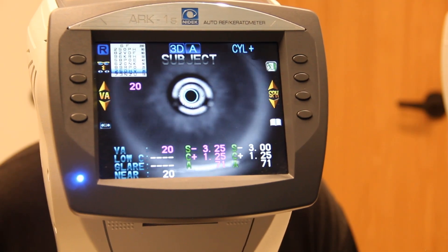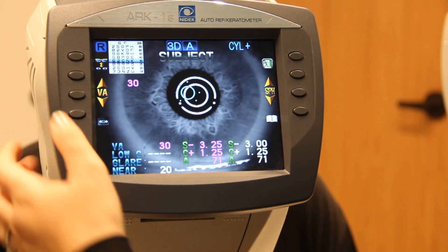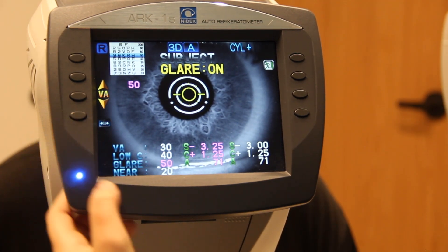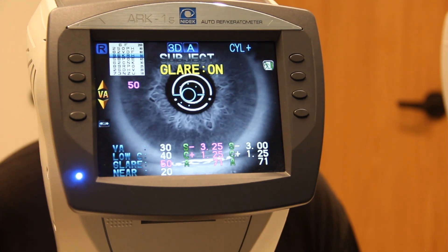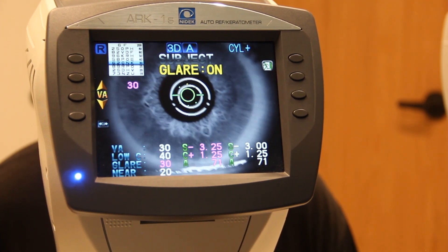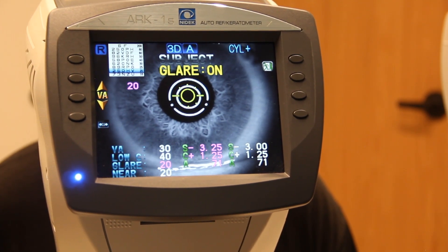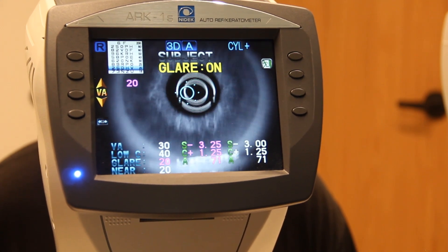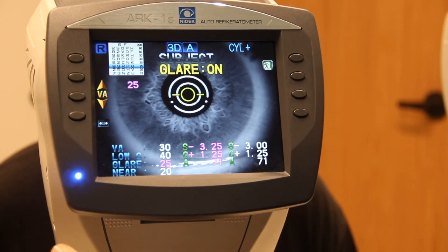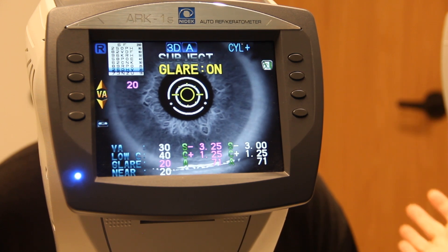Now the other eye: six, two, C, N, K. Hit that glare button twice again — nine, six, K, R, H — six, two, C, N, K — Z, five, D, H, E. He got them. Remember, if he didn't get the 2020 line, go back up to the last line he read so it prints correctly. Since he got it, we're good — the veteran can now relax and sit back.